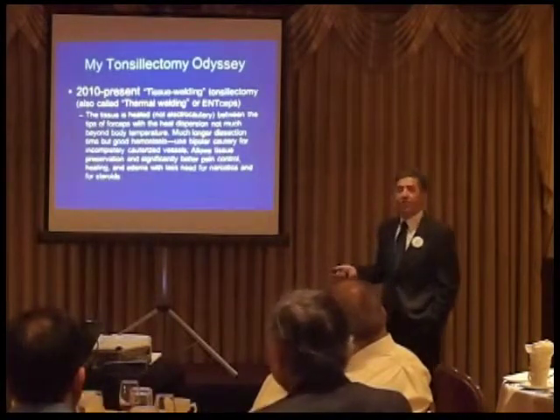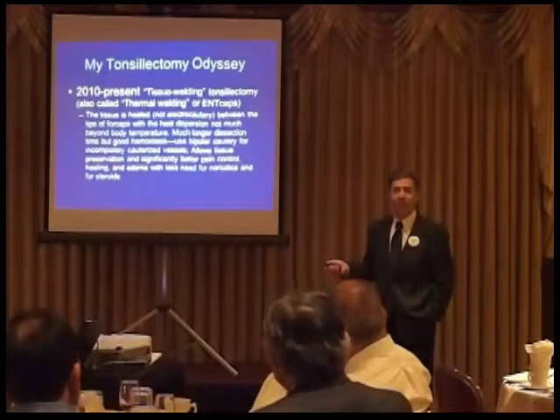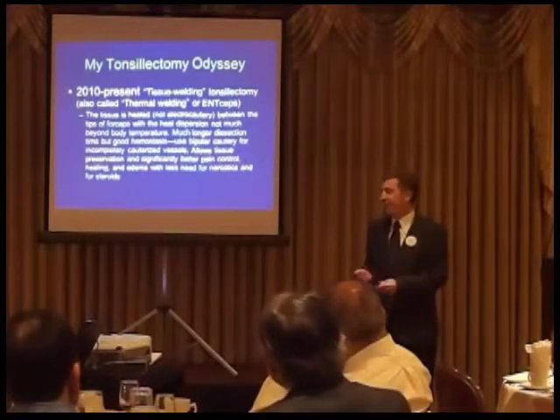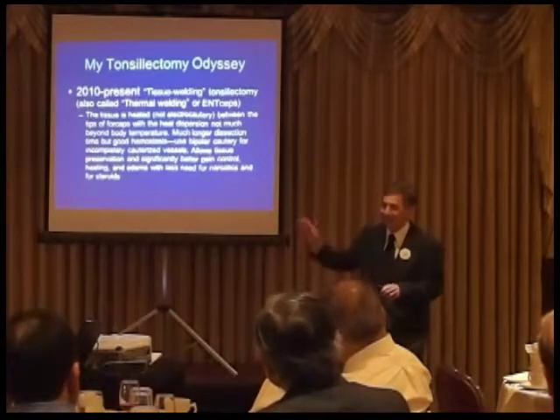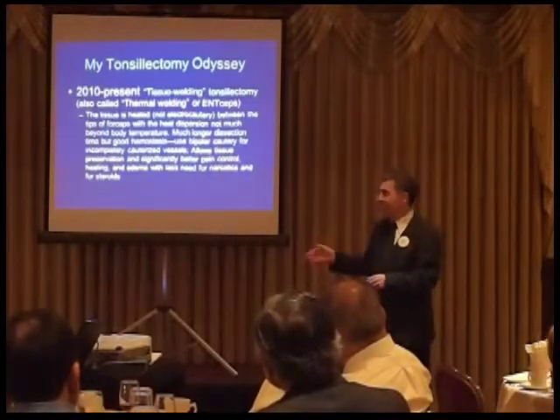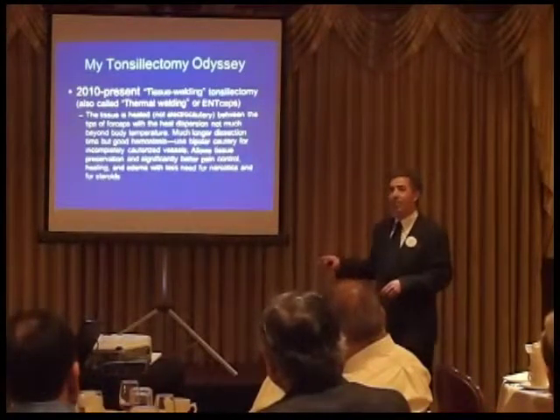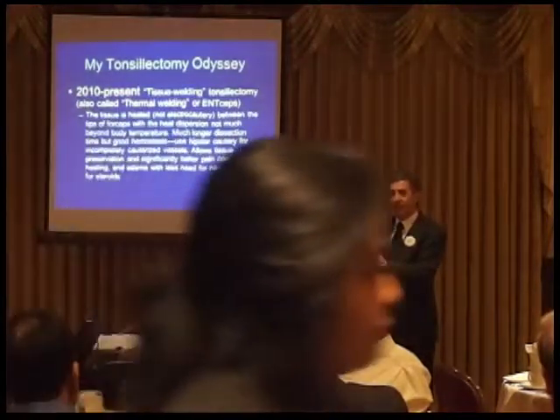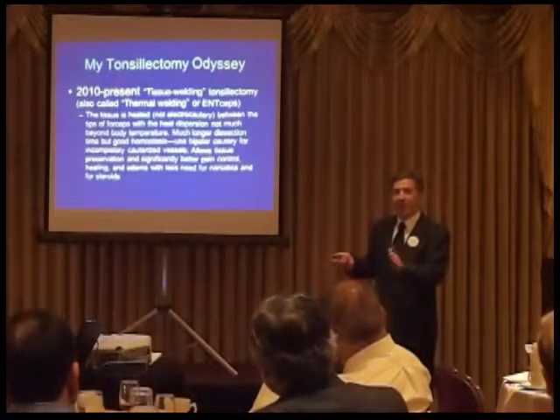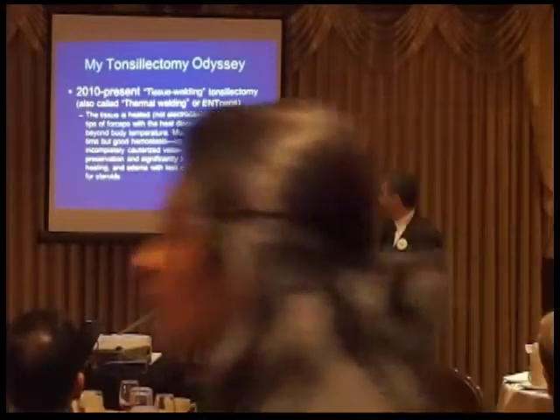And it's interesting, too, because you would think a bipolar cautery at 15 watts is super gentle. I remember when I was in my fellowship, I was bipolaring little vessels on the surface of the cerebellum. I don't do that type of work at all; I really abandoned that. But when you look at the bipolar cautery in the bed of this tissue welding technique, it looks terrible. It looks like you're burning the tissue. It looks grotesquely burned. So it's an interesting indication of how tissue sparing this is.